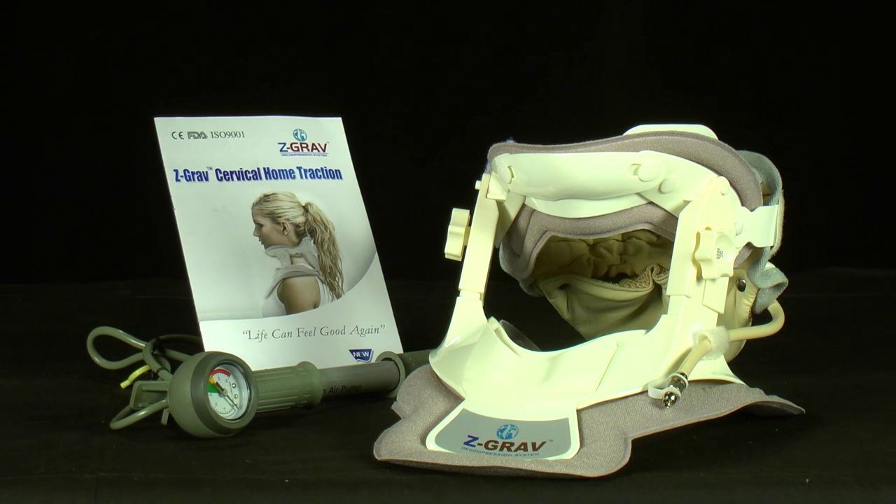The Z-Grav may be cleaned using a damp cloth. Do not expose to prolonged or direct sunlight. Your Z-Grav should be stored in a cool place. Keep out of reach of children.